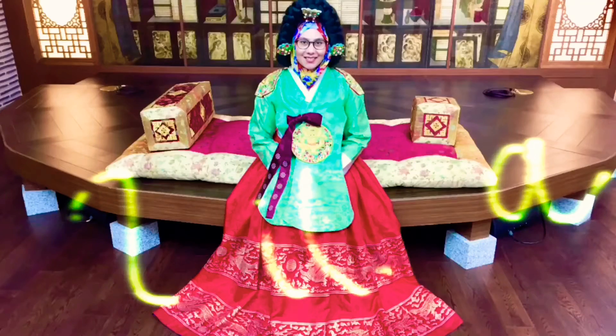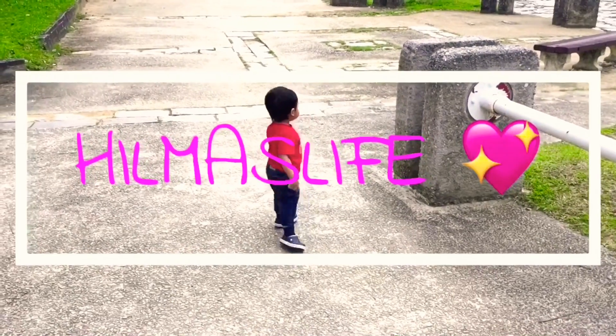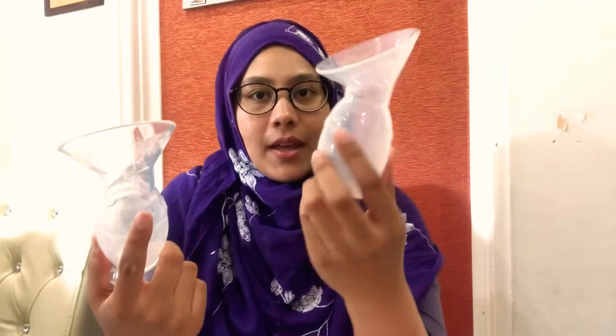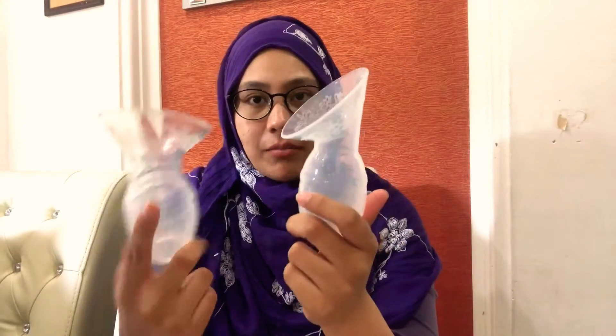Assalamualaikum, hi everyone, welcome to Hima's Live. Today we have another breast pump review, but this one is specific for silicone breast pumps, aka manual breast pumps. In this video I would like to compare two types of silicone breast pump — one from Haakaa, the original founder of the silicone breast pump, and another one from Autumn.